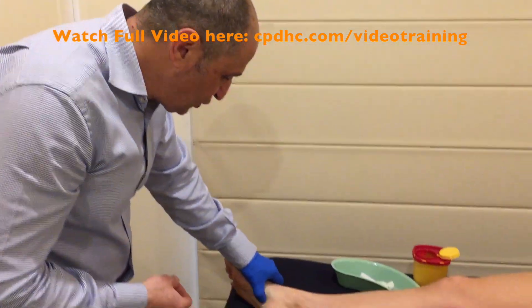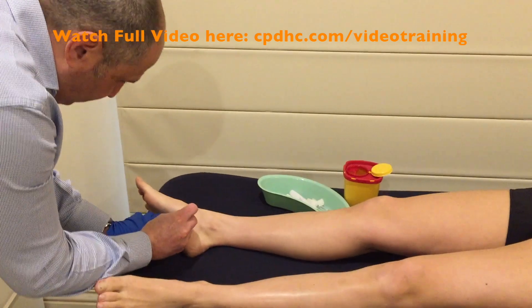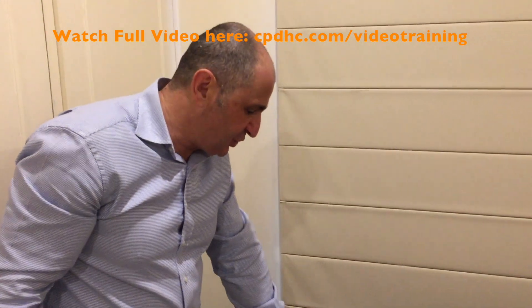Let's have a look at QP just down here. Needling to that muscle is very straightforward and very effective at getting great results in not only local pain around the plantar fascia but also heel pain and of course limited dorsiflexion.